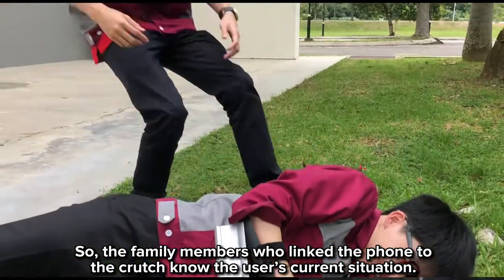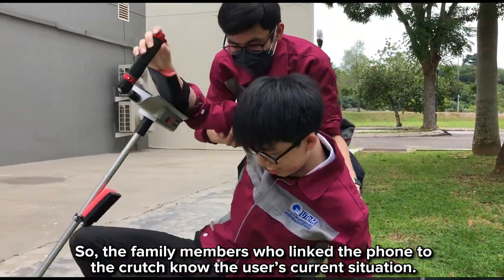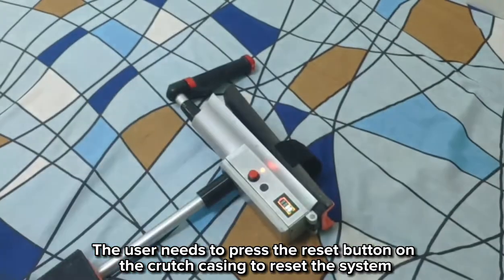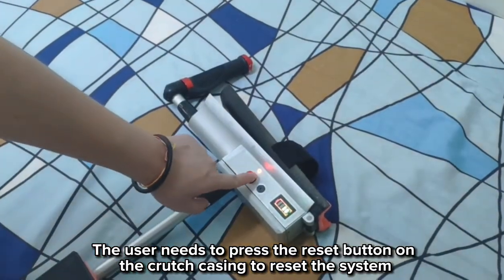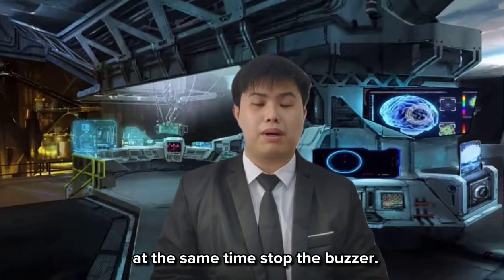The family member can link their phone to the crutch to know the user's current situation. The user needs to press the reset button on the crutch casing to reset the system and stop the buzzer.